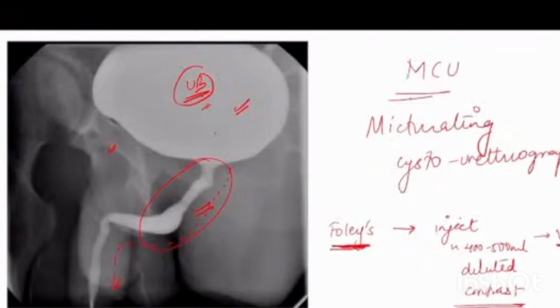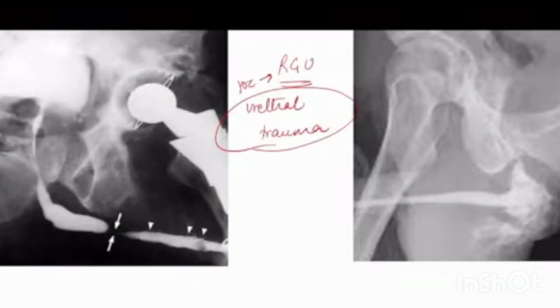So is this investigation possible in any case of urethral trauma? It isn't, right? And this is where they'll trap you. You will be like, I know so much, I've seen MCU so many times. I know that the posterior urethra is the most distended, so that must be it. And see, so fresh from knowledge you guys are. You read it a minute ago and then everybody was like, yes ma'am, posterior urethra means MCU. But again, logic, right? The patient cannot void when he has urethral trauma. So that is why the answer for any urethral trauma, anterior, posterior, lateral, medial, any urethra, is RGU. Remember, we won't do anything else, we'll do retrograde urethrography. Okay, is that clear? So this is the investigation of choice.